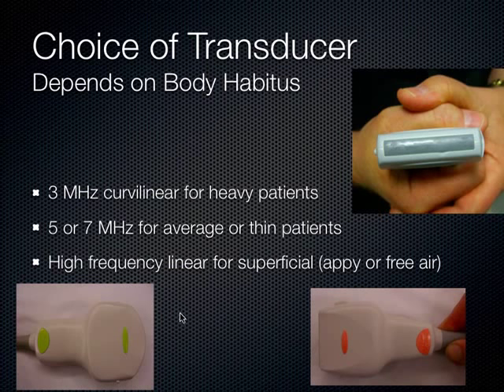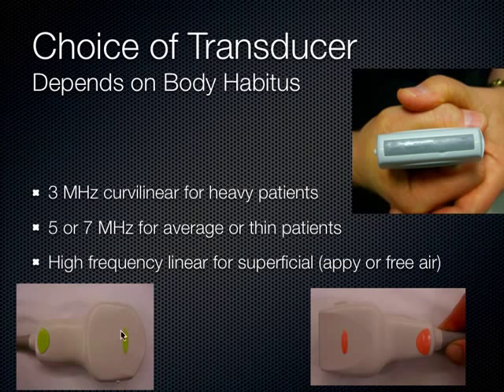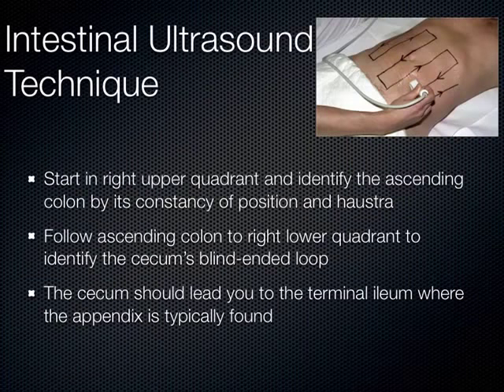Occasionally we have to use the lower frequency curvilinear probe, down in that 3 MHz range in larger patients. But almost always I can get by if I push hard enough with a linear transducer and get really nice images.